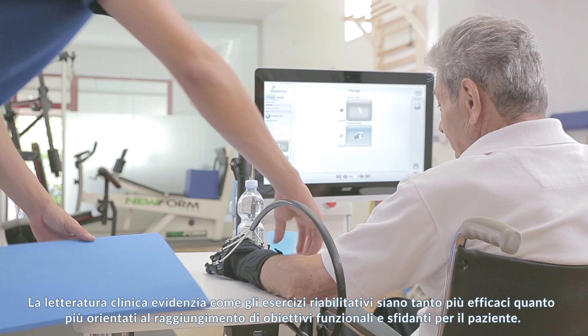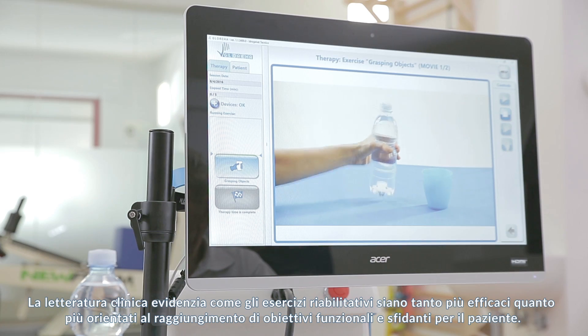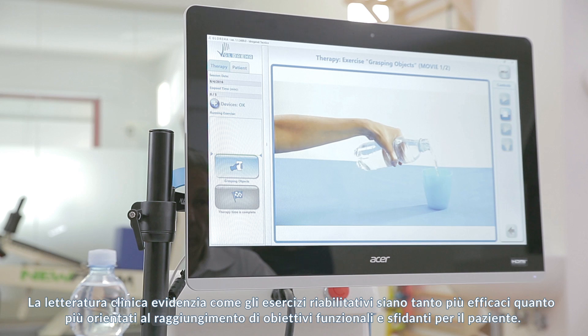Clinical literature highlights how rehabilitation exercises focused on recovery of functional movements and challenging goals can be much more effective on patients.